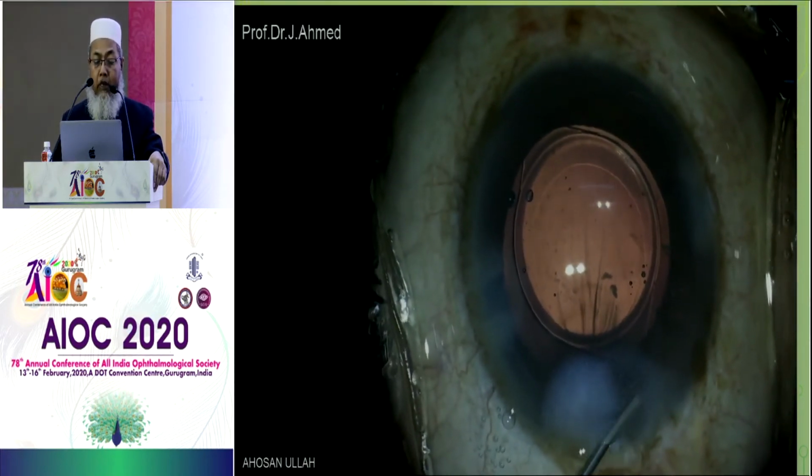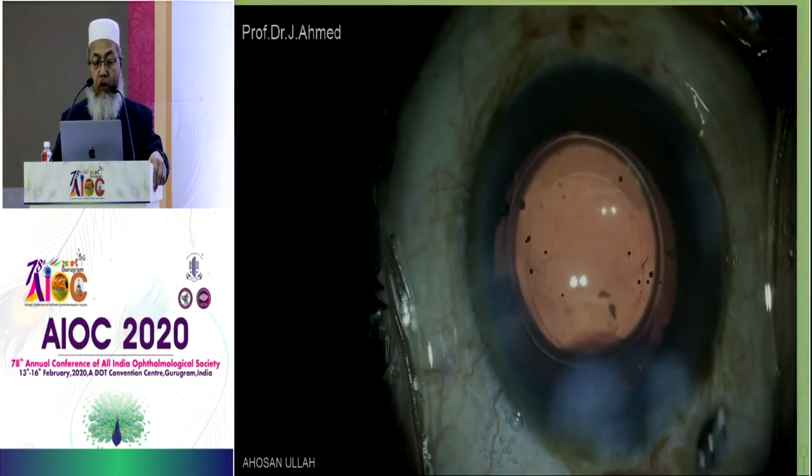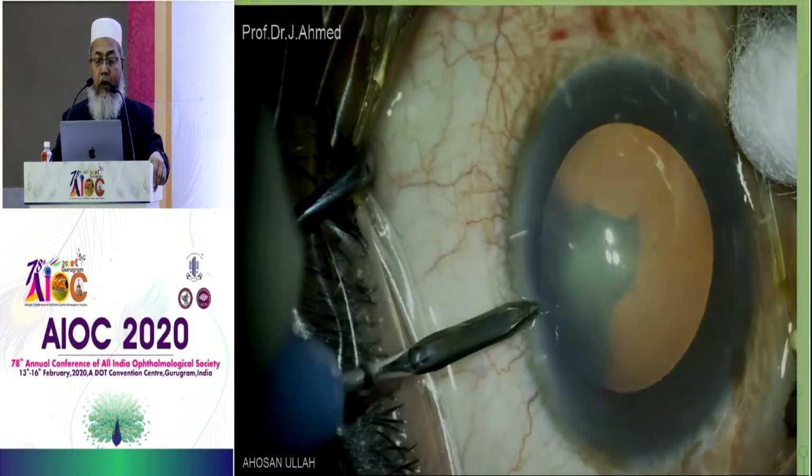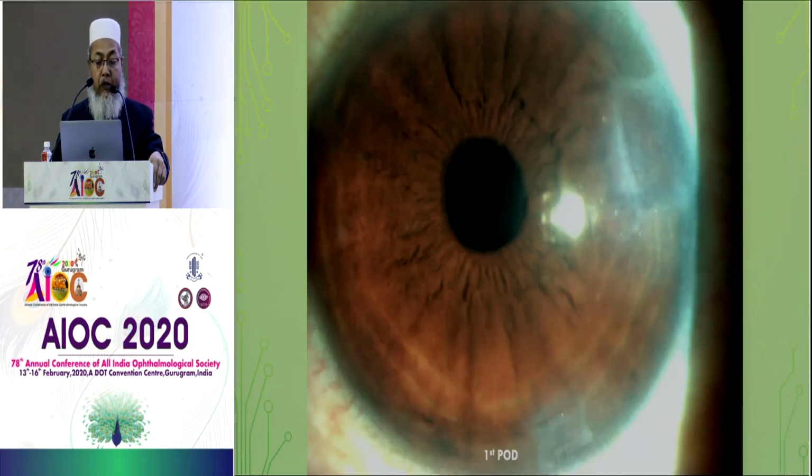Then wound hydration is done to close the eye in a normal way. And this is the first postoperative day appearance of the case.